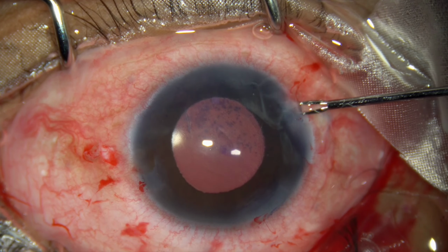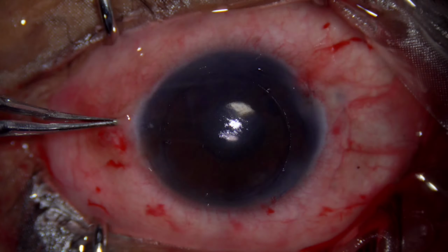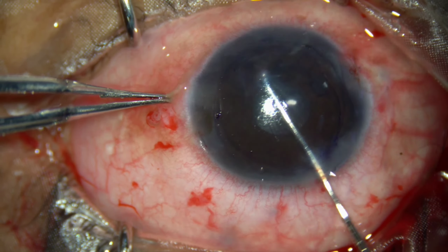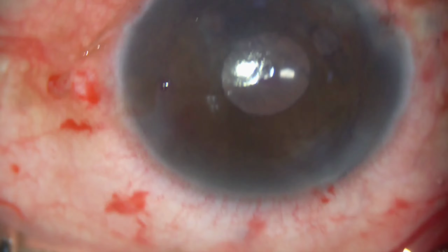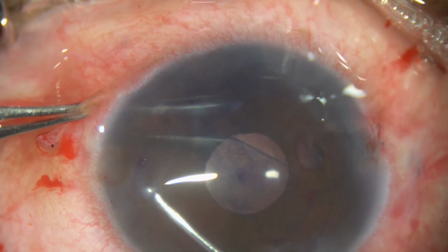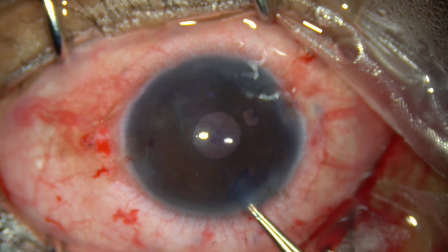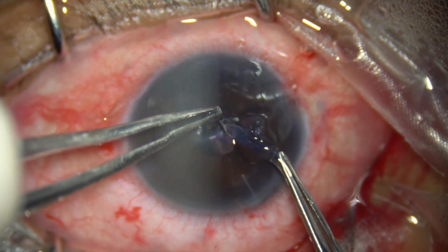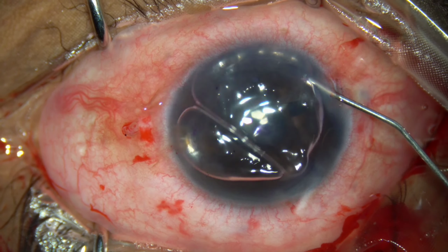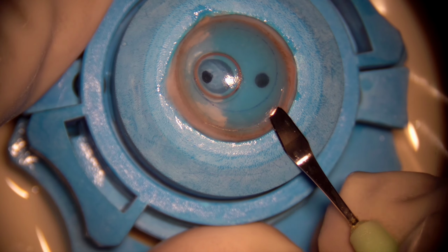After constriction of the iris, a surgical PI is done at around 9 o'clock. And with the help of a Reversed Sinskey hook, Descemetorhexis is performed. The intact Descemet membrane is pulled out with the help of McPherson forceps. After checking the intactness, air is given into the AC. Now the lamellar dissection is done in the artificial anterior chamber.